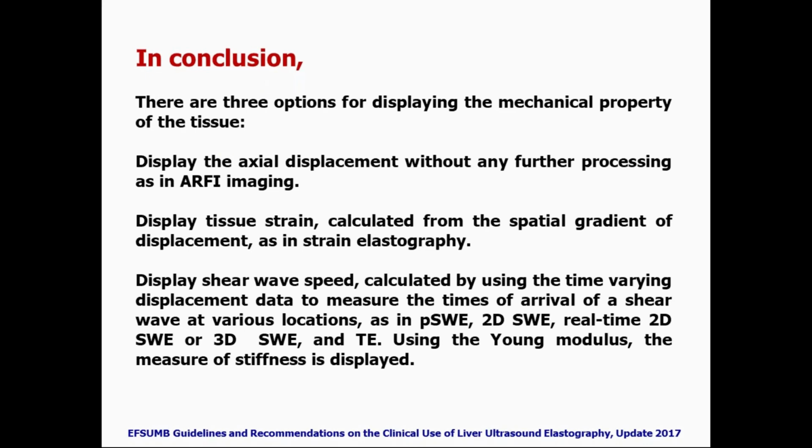So in conclusion, we have three options for displaying the mechanical properties of tissue. Display the axial displacement without any further processing, and this is the ARFI imaging.